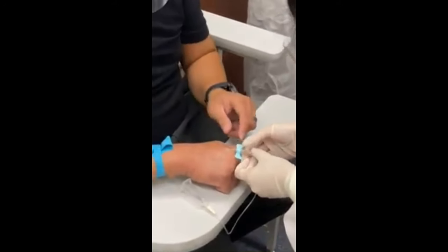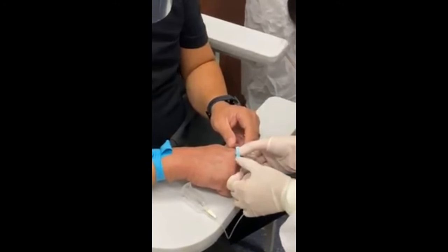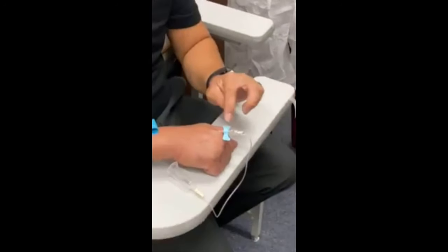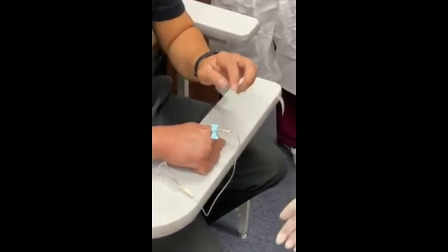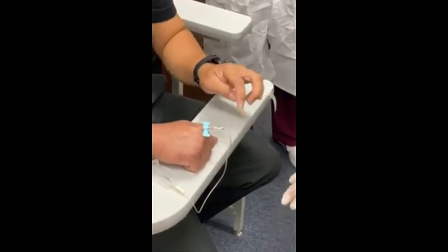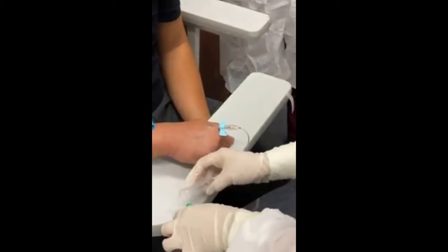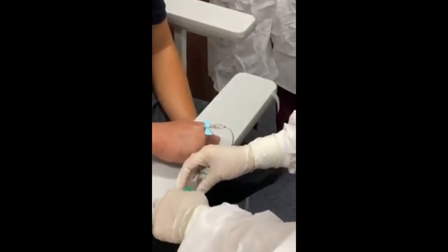Okay, so this one's kind of tricky here. You're fine. You can let go. It's fine because you untangled it, and you can't really put tape because it won't stick anywhere. So you can let go. This is fine as long as you flash. Okay, so I can let it go and just... Yeah, yep, just like that.